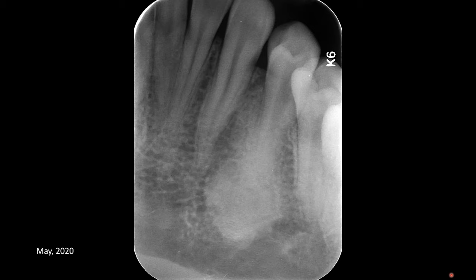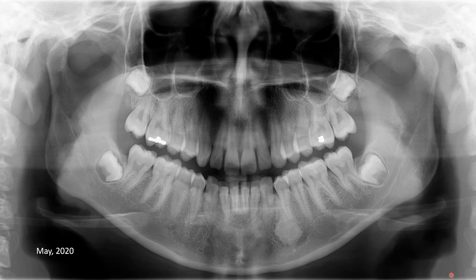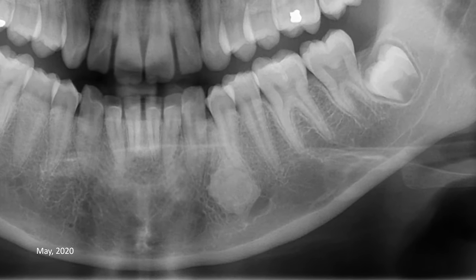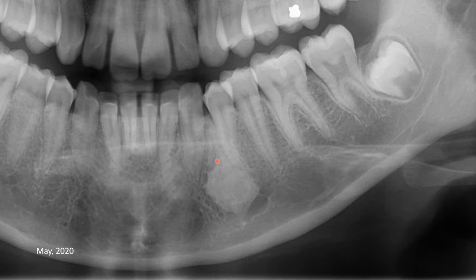Let's review the panoramic radiograph, which was obtained on the same day in May 2020. On this panoramic radiograph we still see the same radiographic features. Let's zoom to the area of the premolar. We have uniform density, and the periodontal spaces of the premolar are better visible on this panoramic radiograph compared to what we saw on the periapical film.